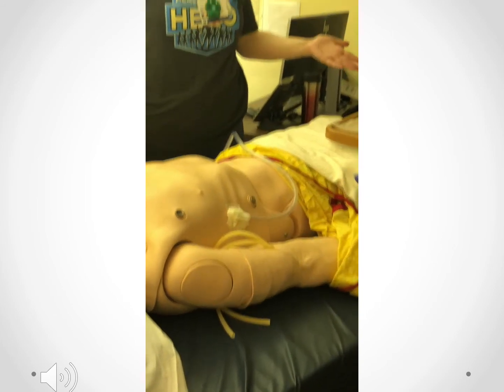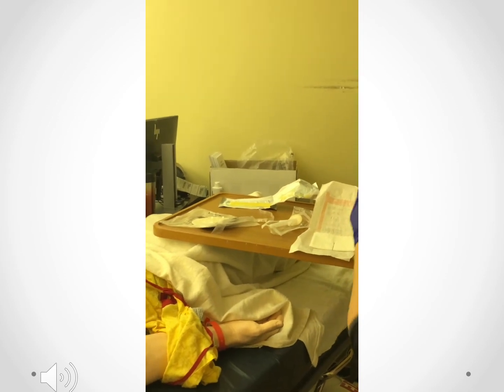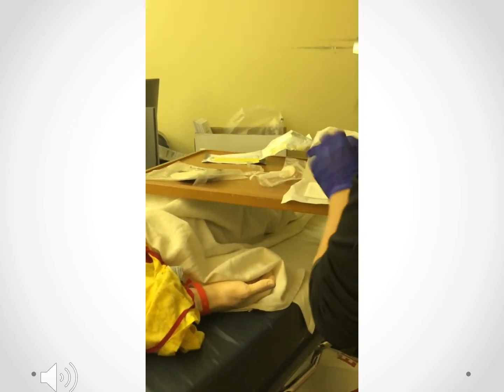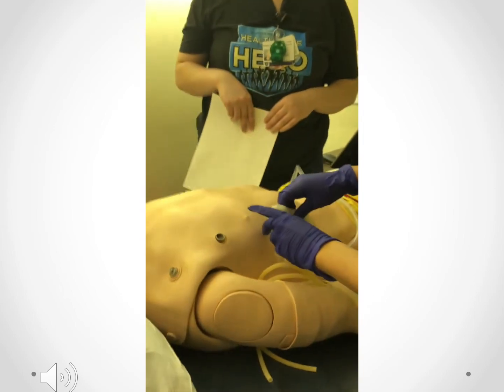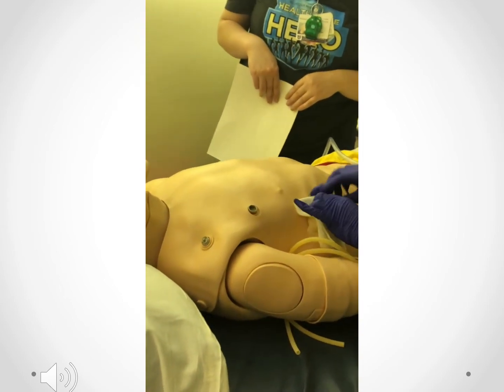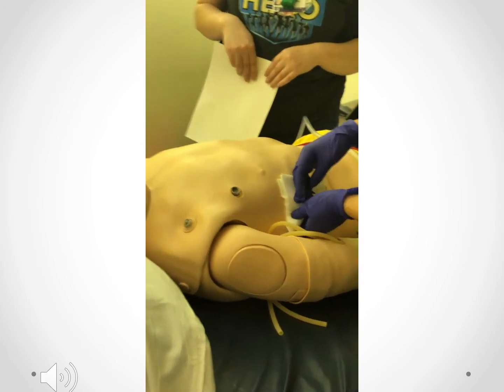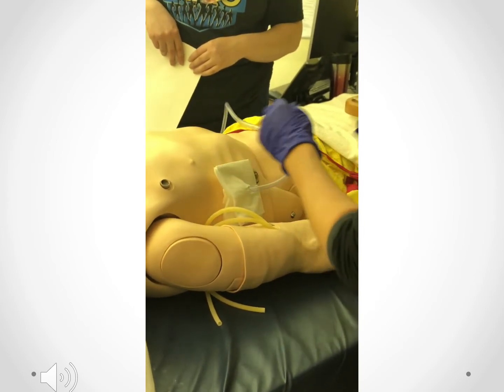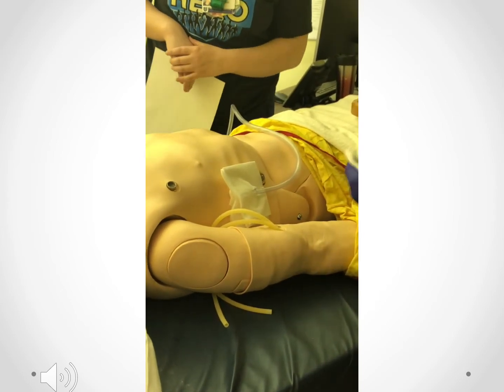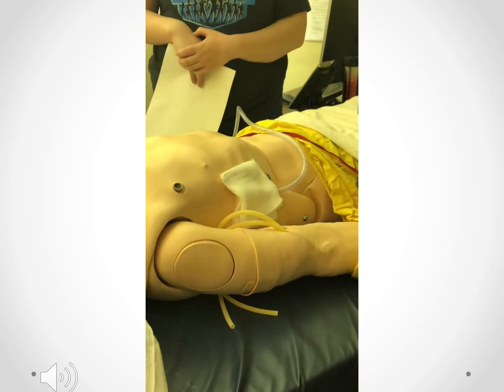In which this gauze is extremely messy, so at this point Katie will remove her outer layer of gloves. And now she will place the split gauze so that it goes around the chest tube. Next, Katie will place the outer layer regular dry gauze on the top, and which she will apply tape.